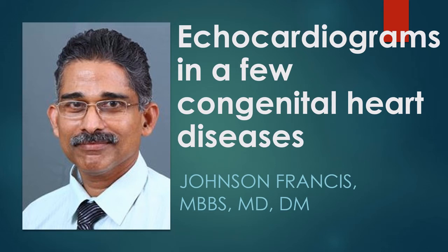In this series, we have echocardiograms of a few congenital heart diseases. The first one shows left ventricle to right atrium shunt associated with a perimembranous ventricular septal defect. Various possibilities are discussed. The second one shows an ostium primum atrial septal defect with tricuspid regurgitation. The third one shows a few views of tetralogy of Fallot. The intact patch at the site of intracardiac repair of sub-aortic ventricular septal defect in TOF is seen in the last few frames.